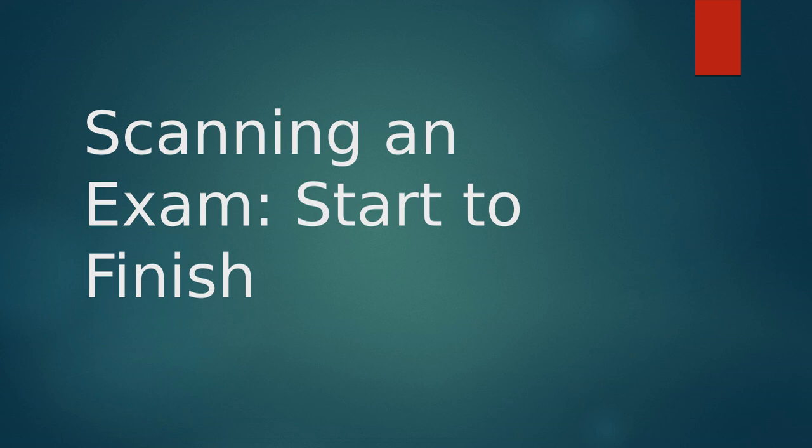Hi everyone. So today we are going to be learning about how we actually perform an exam, some of the major steps that we have to take when we're dealing with our patients. And then also we are going to be learning about our controls and what all of those little buttons on our machine do to our image, how we can adjust them. When we adjust them, what does that do to our overall picture?